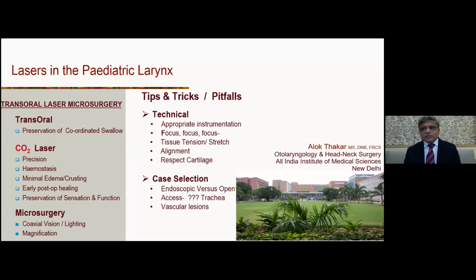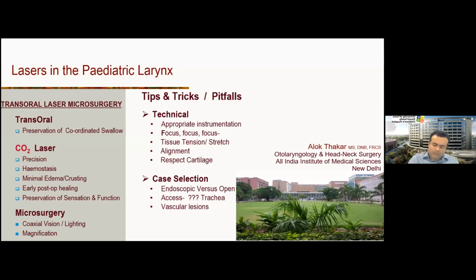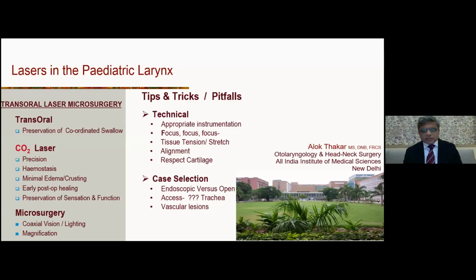So I think laryngomalacia may be one of the prime indications for using the laser for airway problems. Another would be subglottic hemangioma, and as has been pointed out, with the fiber transmissible lasers, you can use a KTP or a diode laser in non-contact mode, and then all hemangiomatous lesions, or a lesion like subglottic hemangioma, can be dealt with by transoral laser surgery.